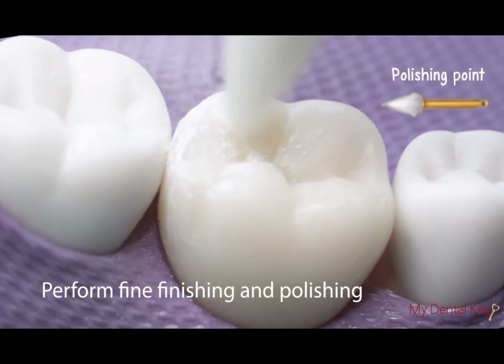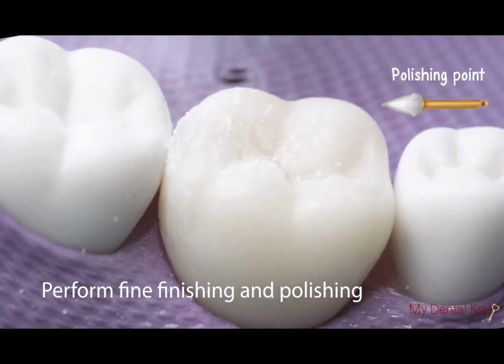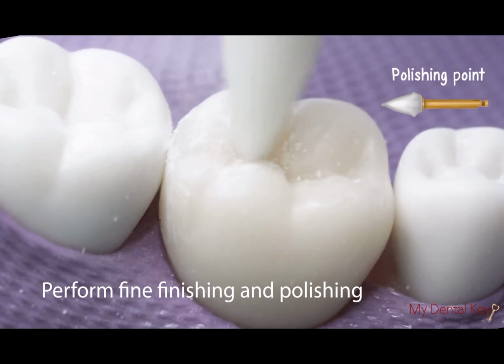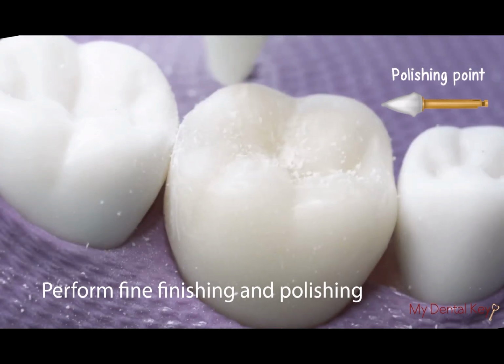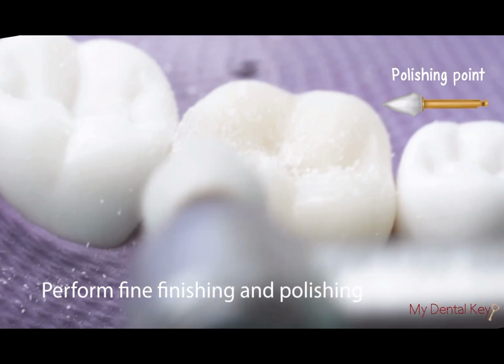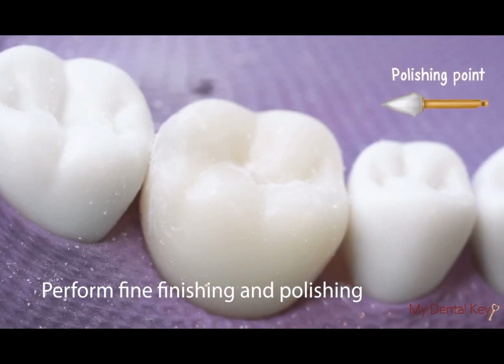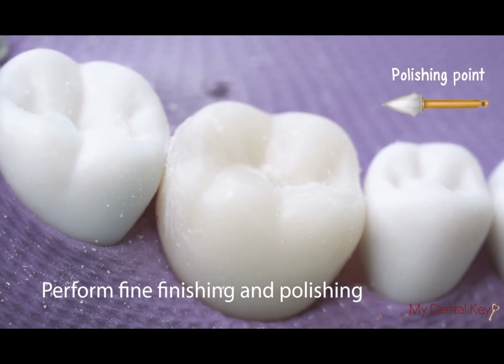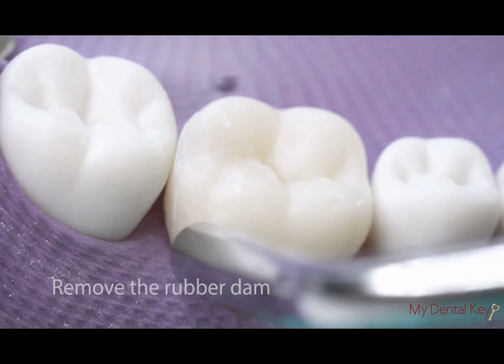After the coarse finishing and contouring, perform fine finishing of the restoration and initial polishing. As a pro tip, the polishing point can actually be quite abrasive on the Odontex teeth. Try not to exert too much pressure, as you might wear away the simulated enamel on the Odontex tooth. Since the CDCA requires you to have minimal to no enamelplasty, this is something to definitely watch out for while performing your restoration. At this point, you may remove the isolation.